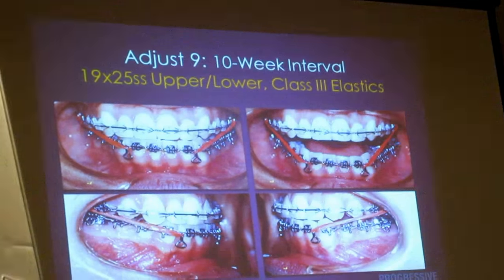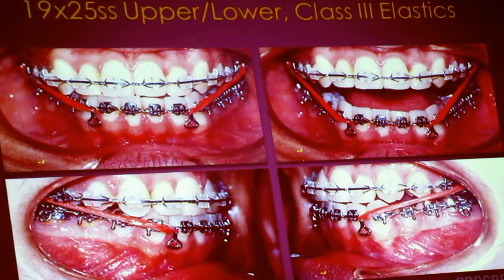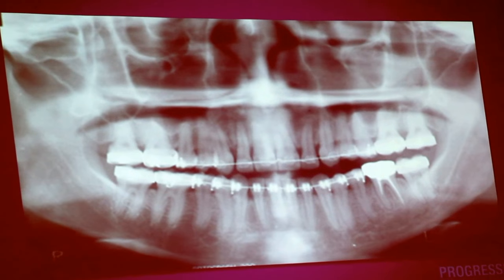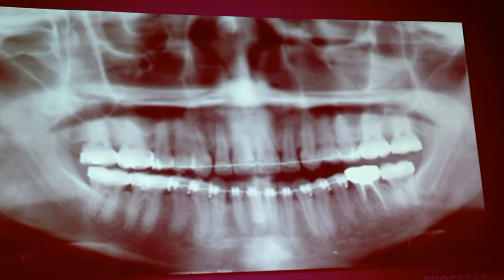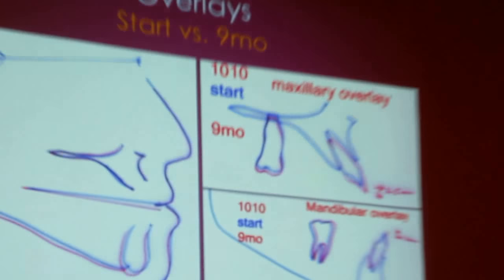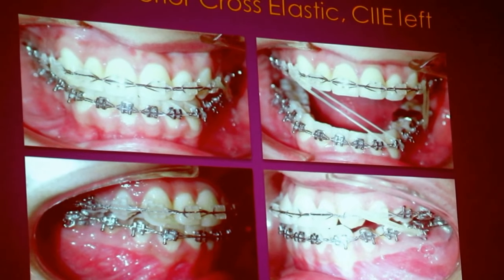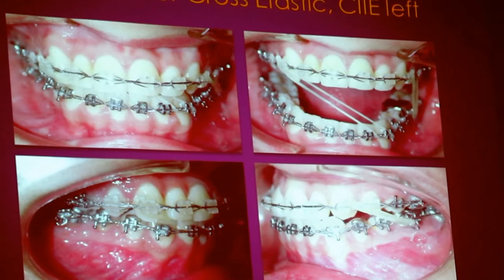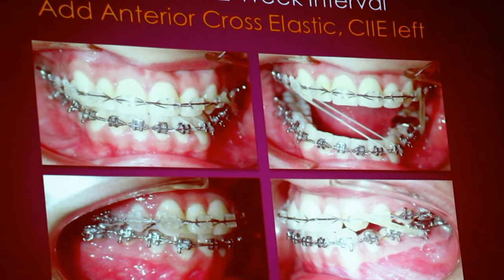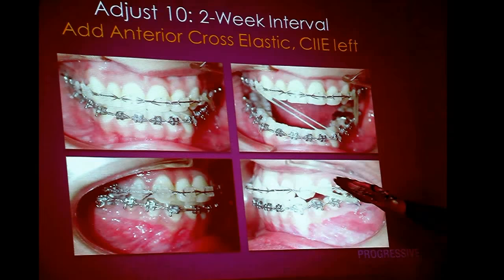Remember the little loop in the arch wire? That's very standard. Instead of putting like a little old-fashioned keyhole, you know, it's very common. I could live with the lowers. So I would change a little bit. I won't get into this much, but overlay. This is called an anterior cross, the one that's on the upper right. Anterior cross elastics are mostly used if you have to shift midlines. That's true elastic. This one right here.